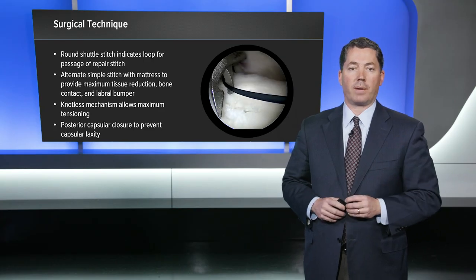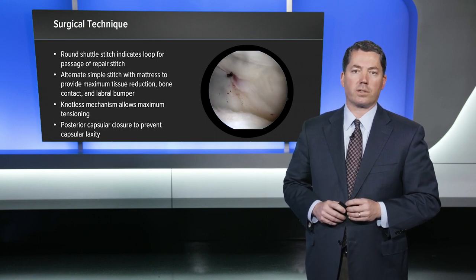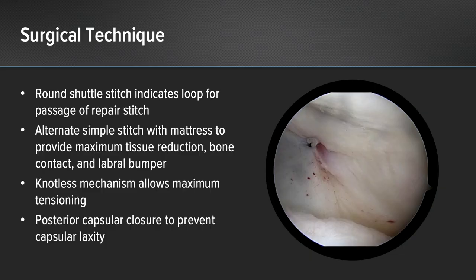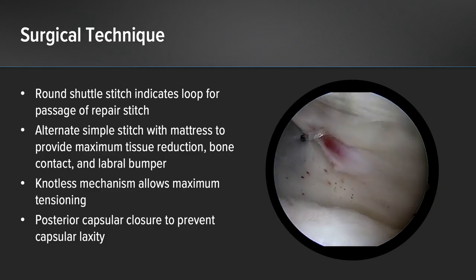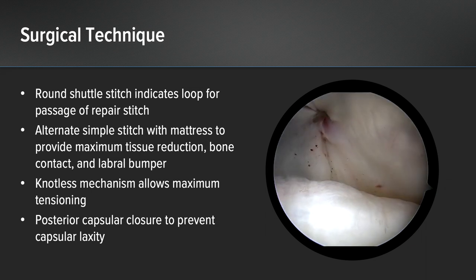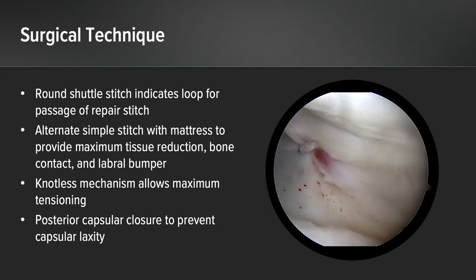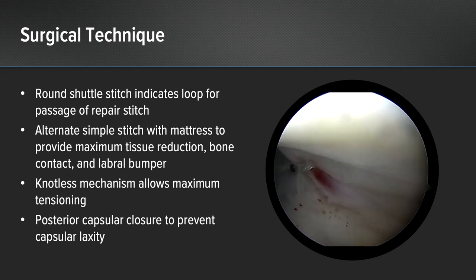The last thing I like to do is a posterior capsular closure. On all of my unidirectional posterior instability cases, I think preventing capsular laxity and venting the capsule is important. We know from the hip and other joints that having a capsular hole causes some instability in certain cases, so I use the suture lasso to pass the suture through the posterior portal and close my portal prior to closure.